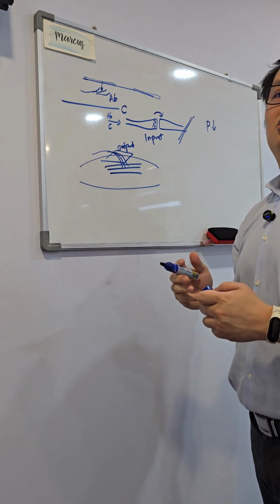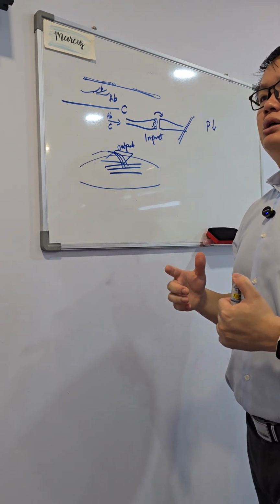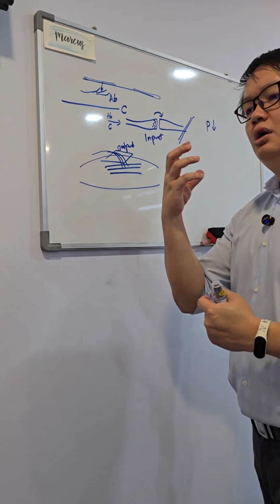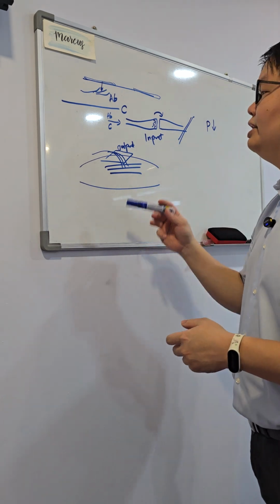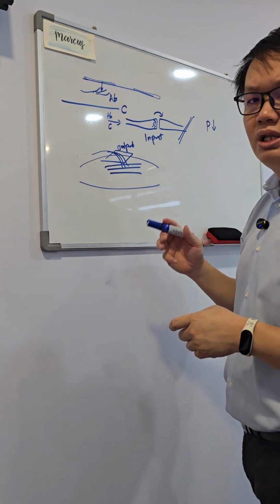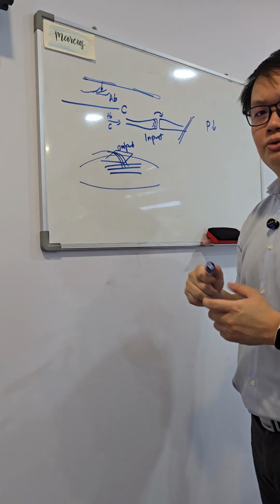Motor points are specific to that particular nerve, for example the axillary nerve that supplies the deltoids. Then they have most motor points around the posterior deltoids. So put one around the posterior deltoids as the area where we send the signals, and our target is to achieve a muscle contraction.